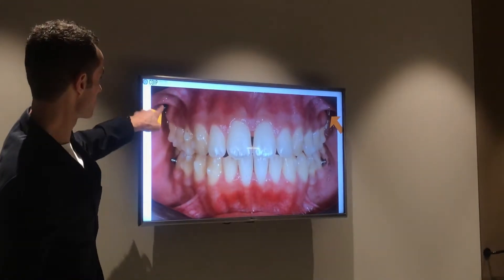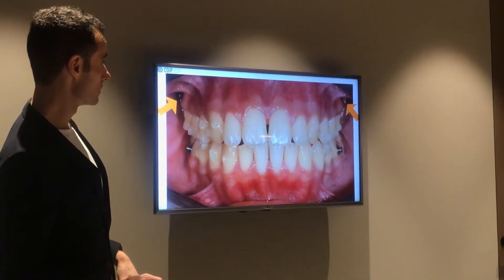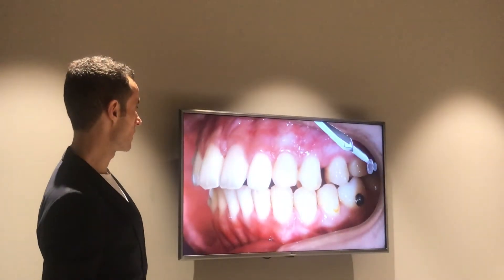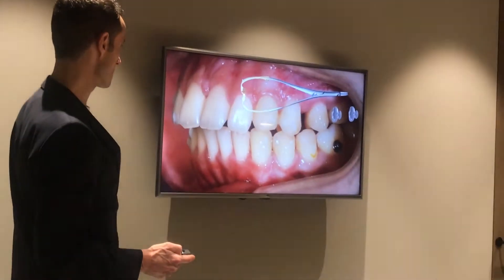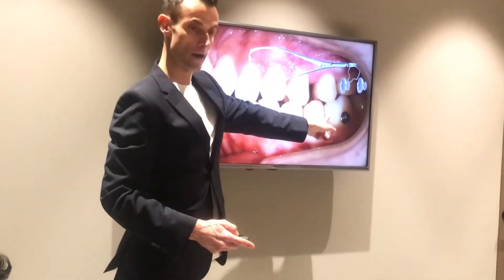Look at the indirect and direct anchorage with the metallic ligature. You see the direct anchorage? Now we do it on the other side — exactly the same. Look at the 5 in class 1.